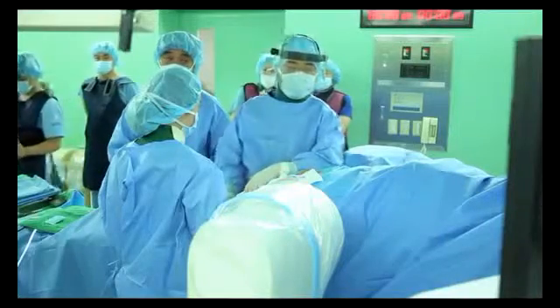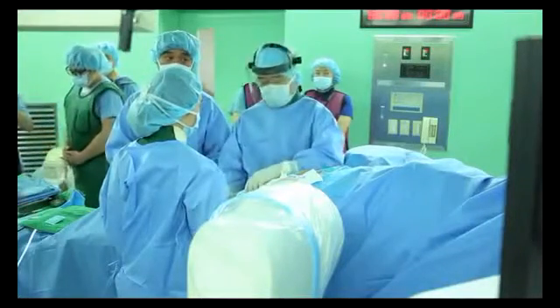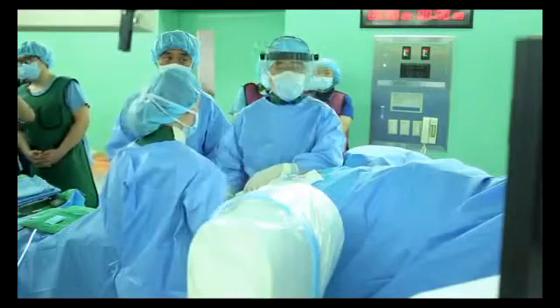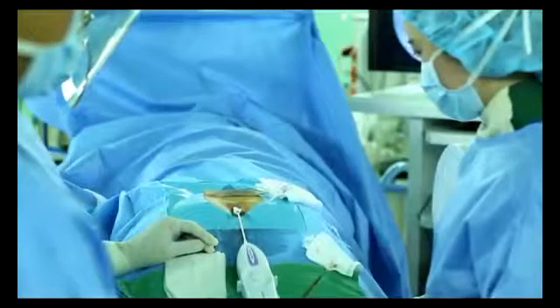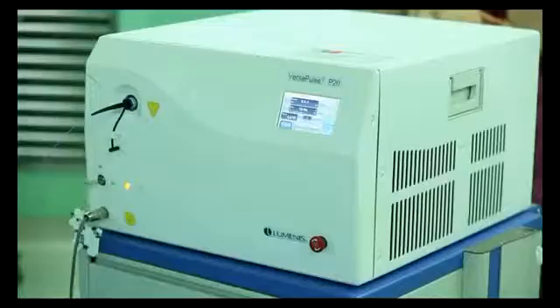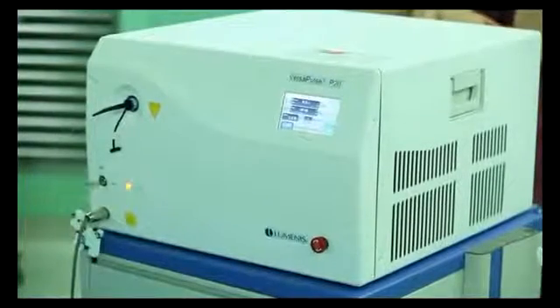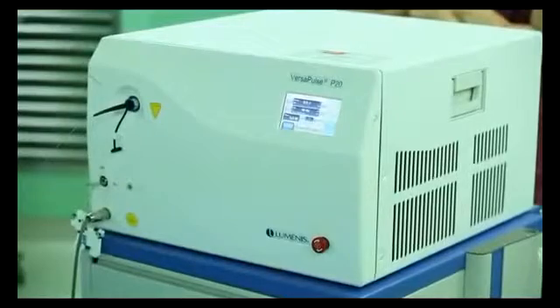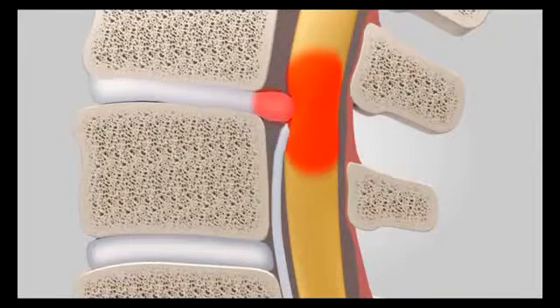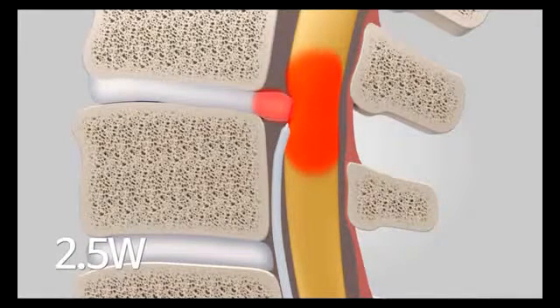The patient may complain of an intolerable heat sensation, although the laser fiber is not touching the nerve, while the nerve has been injured by thermal energy. Then, you should irrigate saline to cool down the temperature around the nerve. This is an additional tip for you. If the disc is located near the nerve, you had better fire the laser at 5 watts, not 8 watts. If the disc is much closer to the nerve, you are requested to focus on firing the laser at 2.5 watts to the target point, and you will see a good result.